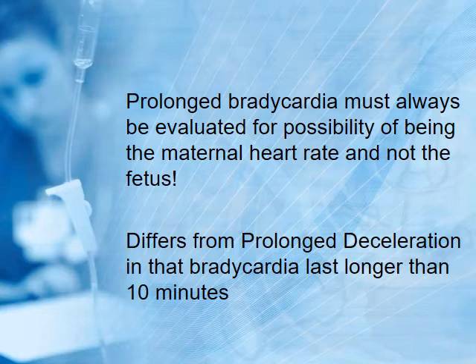Internal monitors, the internal scalp electrode, weirdly can also sometimes pick up the maternal heart rate instead of the baby, and that's if it's loosely applied, if it's coming loose off the fetal scalp. So if you get an 80 on an internal, it's probably the baby, but double check by listening, doing a maternal pulse. Okay?